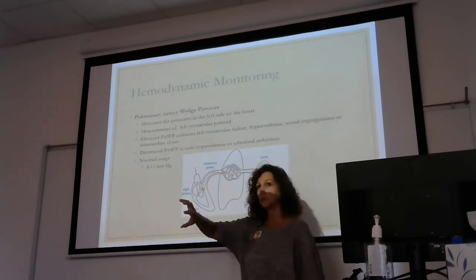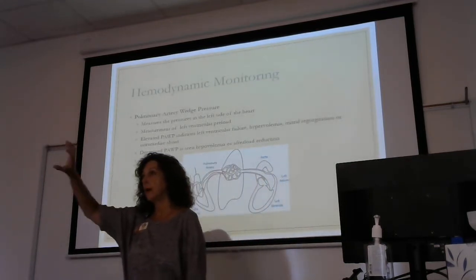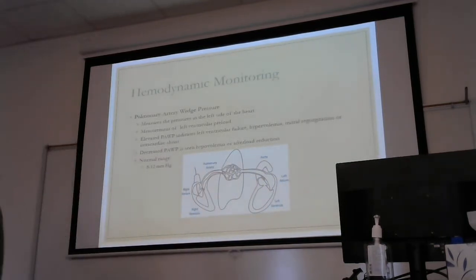If the left ventricle's failed and volume backs up to the atrium, we know that from the atrium it's going to go to the pulmonary bed, isn't it? So if my PA pressures are rising and my wedge pressure's rising, I can be very strongly suspect that we've got too much volume backing up to the lungs. Okay? That's what a wedge pressure is going to tell you.